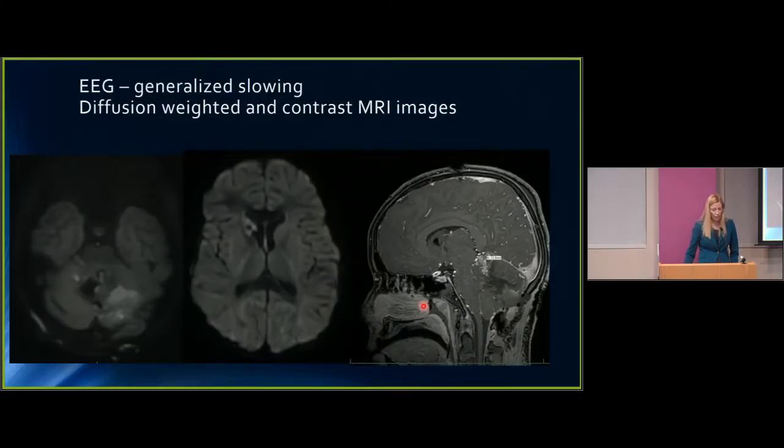So here's what his anatomical MRI looked like after his posterior craniectomy. He had differences in diffusion-weighted imaging in the posterior fossa here, and then also somewhat diffusely you can see there are these brighter areas in the deep areas of his brain. Some are along his cortex, but largely there was normal signal out here. But we didn't know why for 2 months he didn't improve, and our palliative care service offered redirection of care to his family toward comfort care measures.